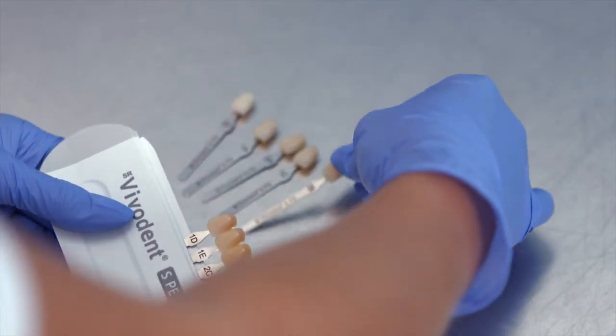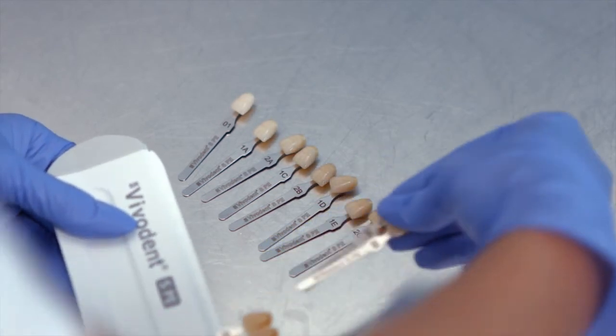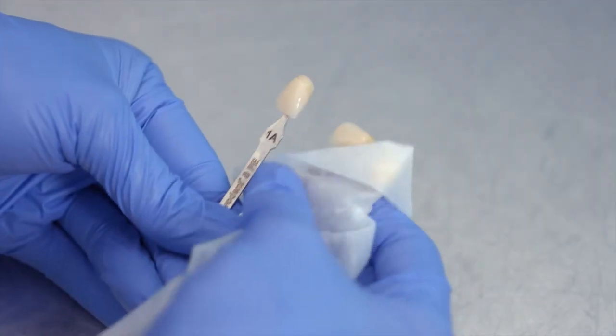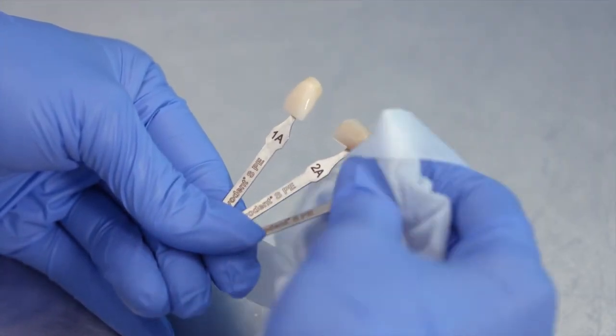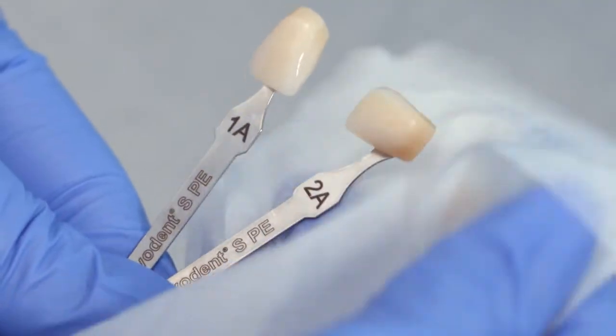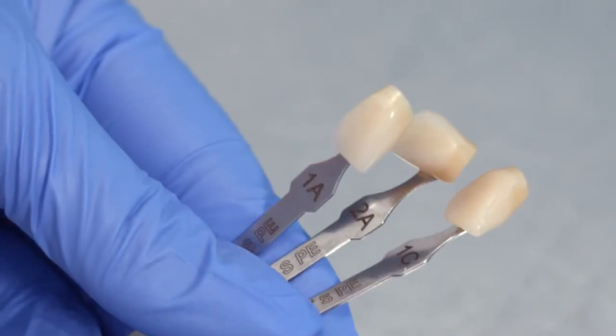Clean and disinfect the instruments before every use. Only use equipment that is in full working order technically and hygienically. Clean the Shade Guide teeth by wiping with disinfectant, for instance, with disinfecting wipes. Wipe the teeth for at least 10 seconds. Dry the teeth with compressed air or with a clean, lint-free cellulose cloth.